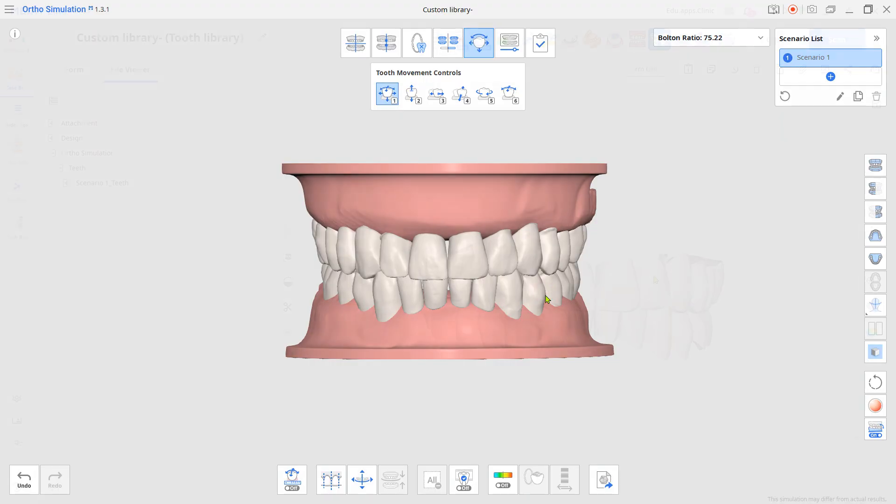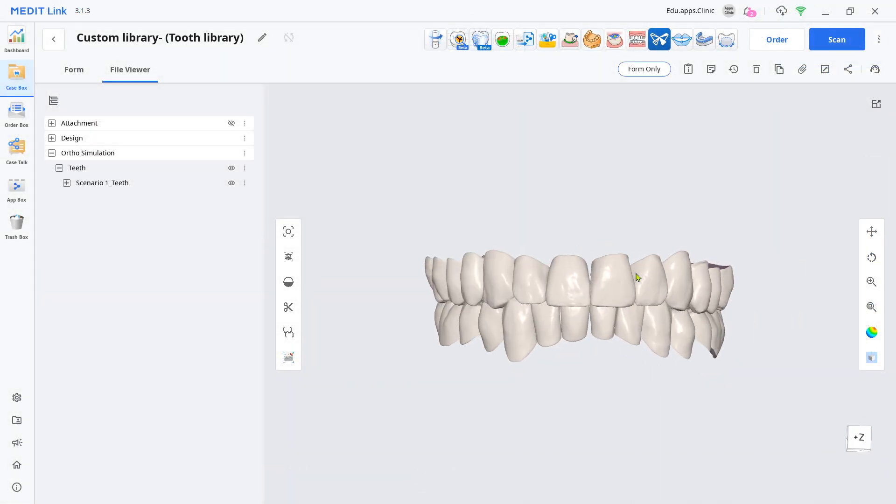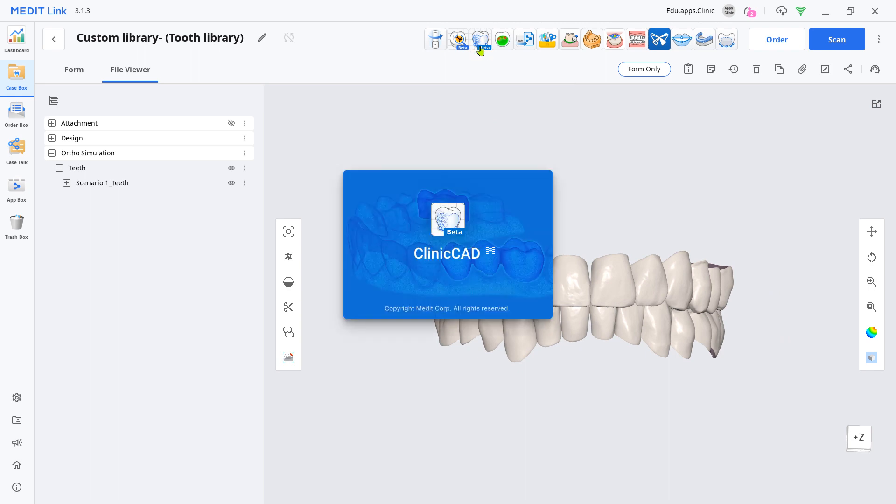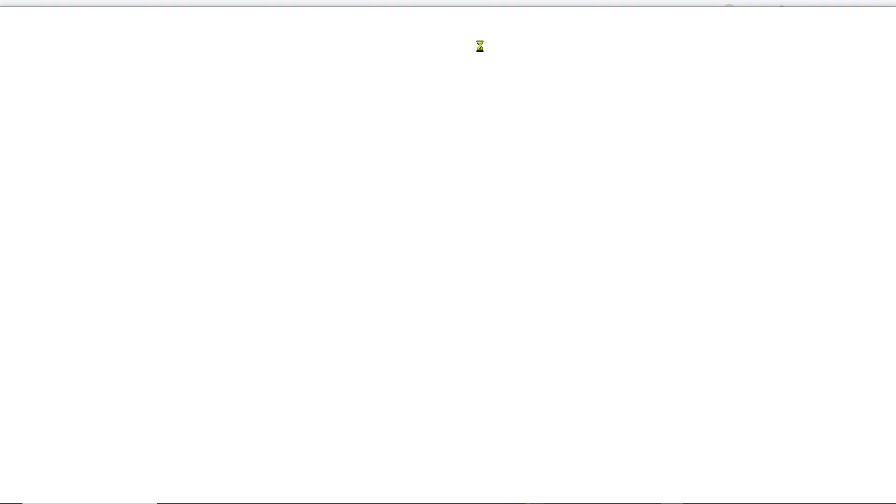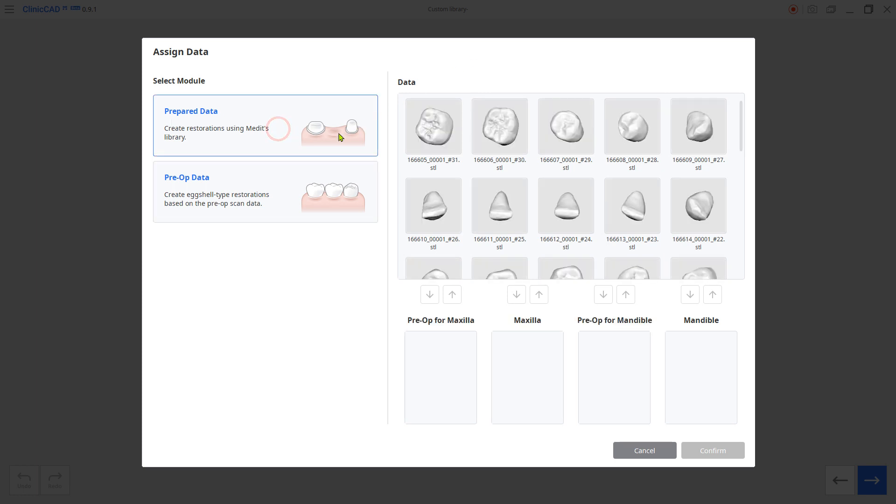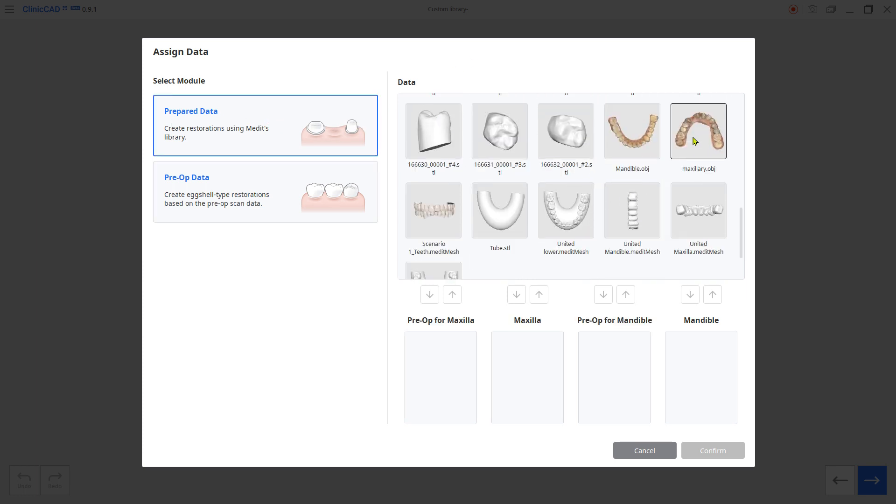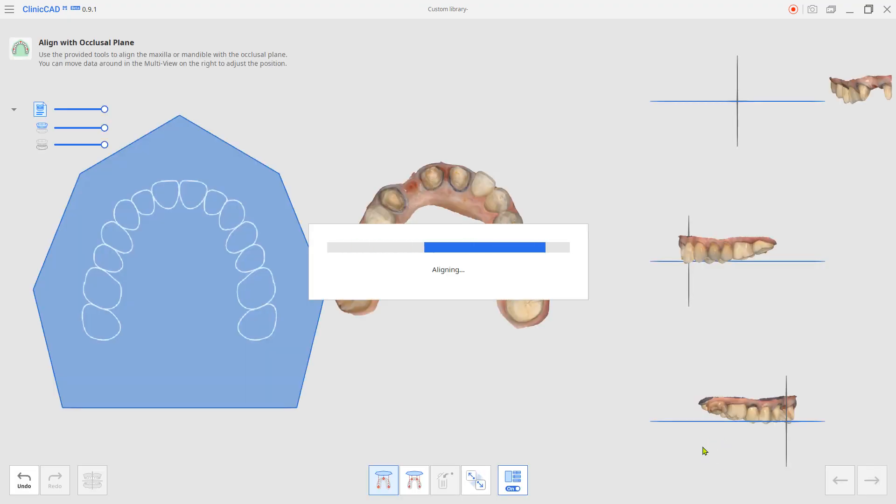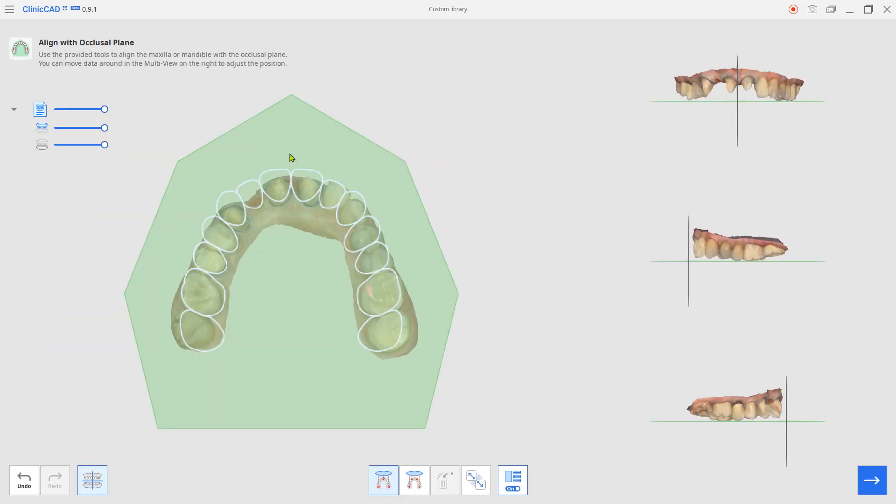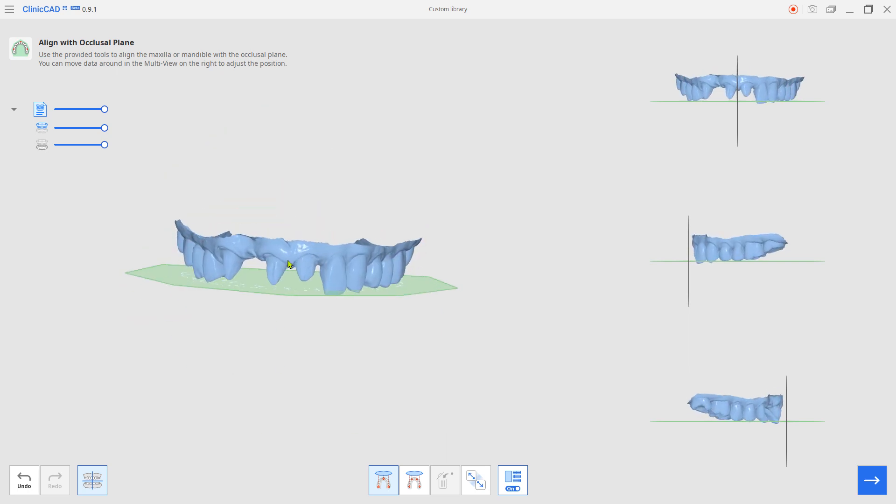Return to MeditLink and load the Clinic CAD app. Choose prepared data mode and assign your scan data. Set up the teeth along the process.